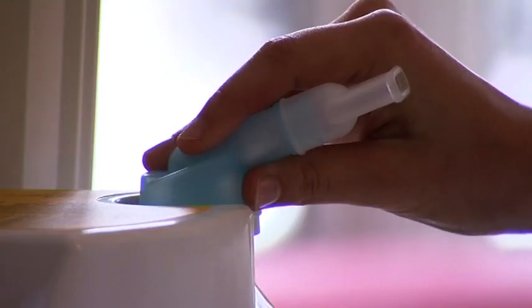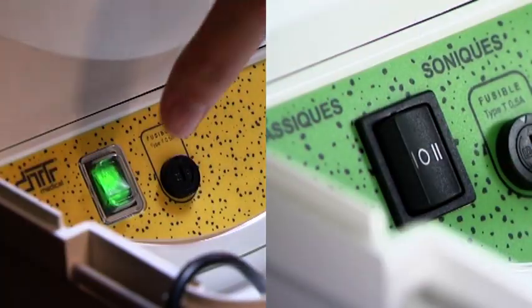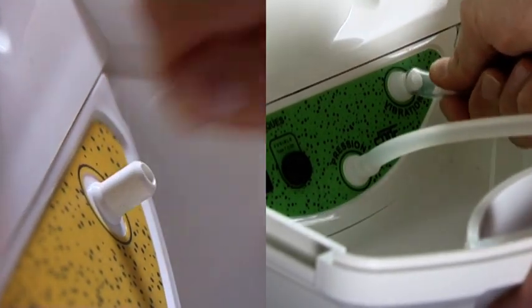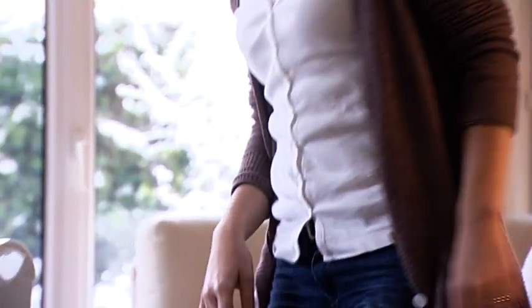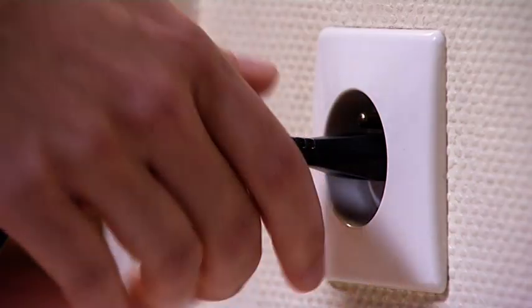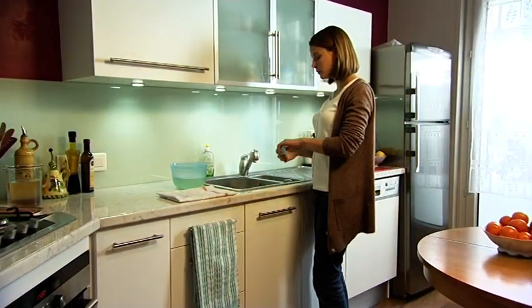Place the nebulizer on the compressor. Switch the compressor off. After each inhaling session, remember to disconnect the tube or tubes from the side of the compressor. Disconnect the electrical plug too. Proceed now with the cleaning of your nebulizing kit.